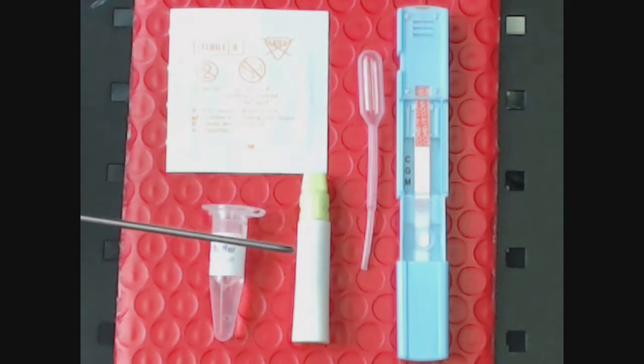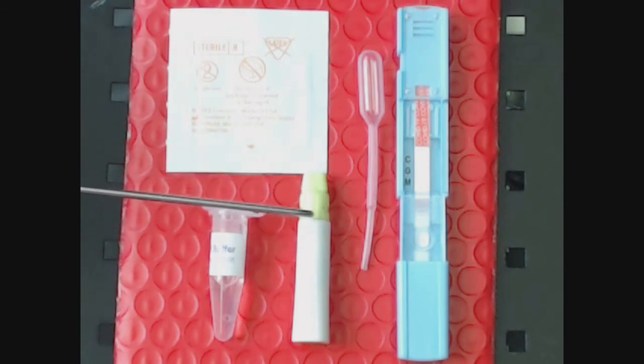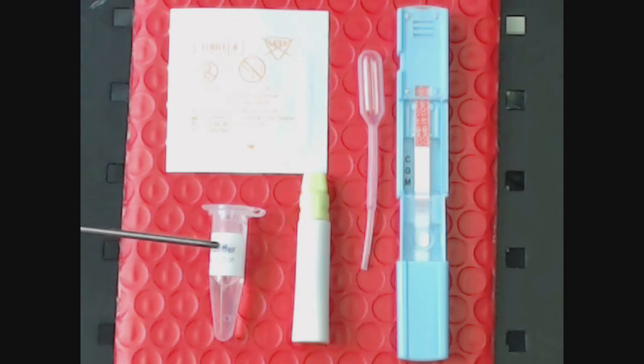This is a spring-loaded safety lancet. You just screw this off, and then you just put the end of this right against the skin and push forward. It springs and will draw your sample.